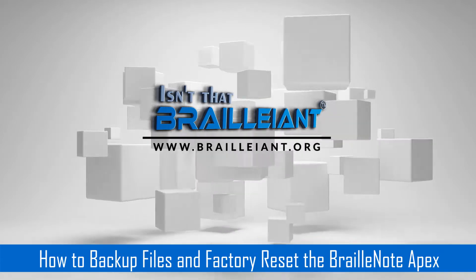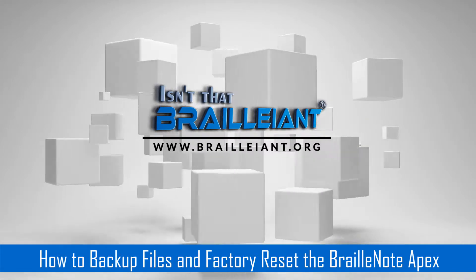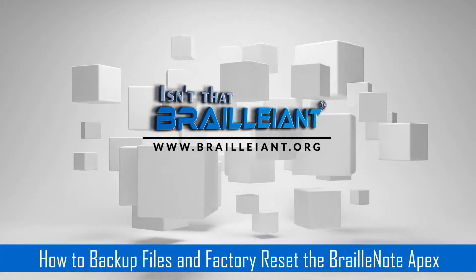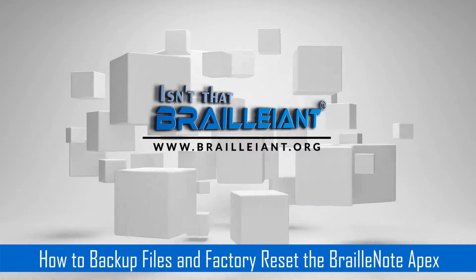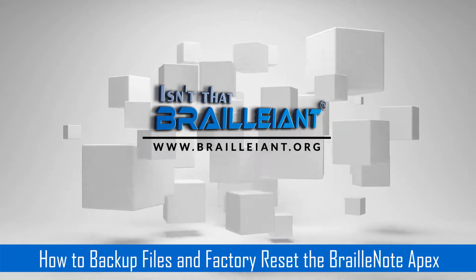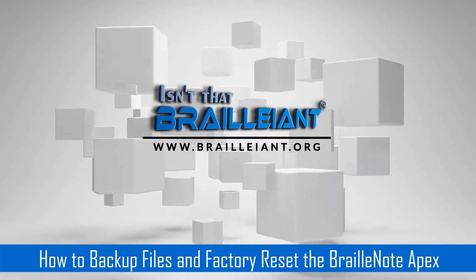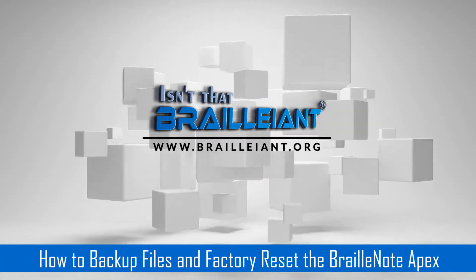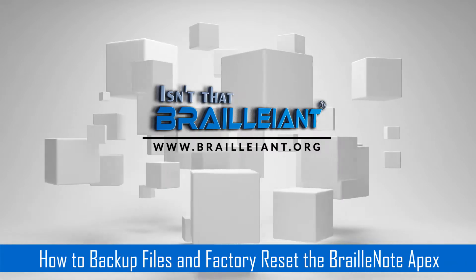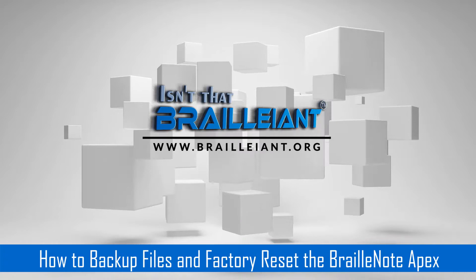Now we need to perform the factory reset command, which is backspace with ER contraction. When you press this command, the BrailleNote will prompt you — 'Warning: all settings will be restored to factory defaults, and all data stored on the device will be permanently erased. Are you sure you would like to continue?' Now that I've backed up all my files, I'm ready to perform the procedure. Press Y for yes. You might want to think about it for a minute before pressing Y; if you change your mind, just press N.